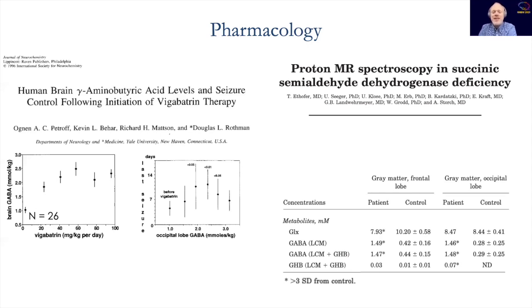These studies show that specific abnormalities in the GABA system are detectable using MRS, and that we can also target drug treatment and the effect of drug treatment in certain studies, although there are also plenty of studies out there that don't show any differences with the application of drugs affecting the GABA system, either directly or indirectly.